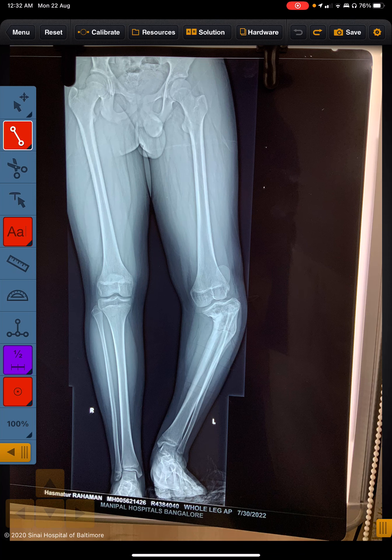Hello friends. Today we are going to see how to easily do deformity correction planning on your Ninja app. This is a case of a young boy around 16 years old with a distal femur and proximal tibia deformity. We need to calculate where to correct, and what the limb length discrepancy is. Let's see the MAD first.